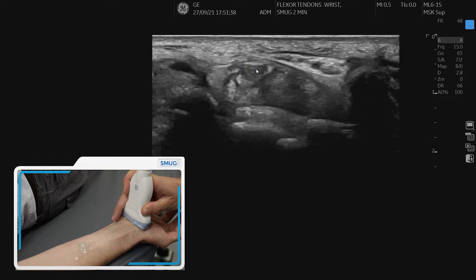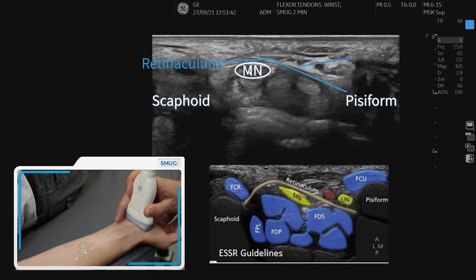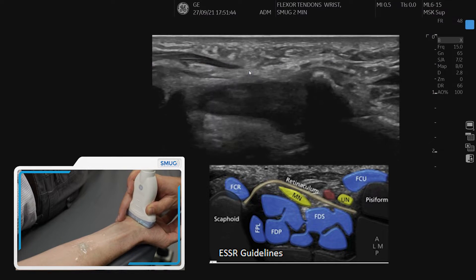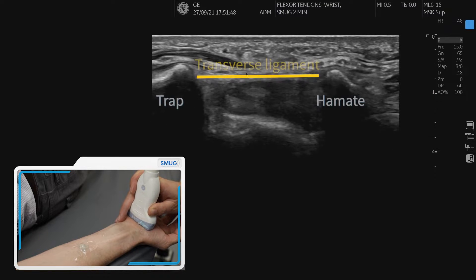If we follow it further down and tilt the probe, we can see a nice image of the median nerve, and as we keep going down we can actually see this very thick band here which is the transverse ligament.